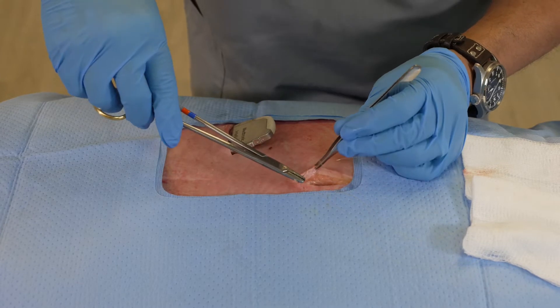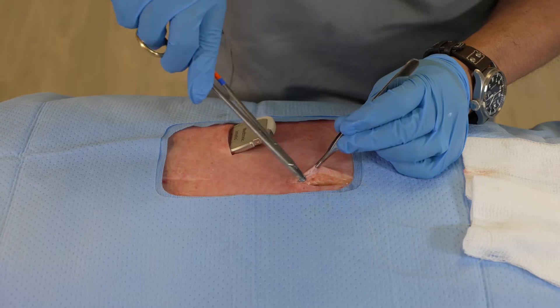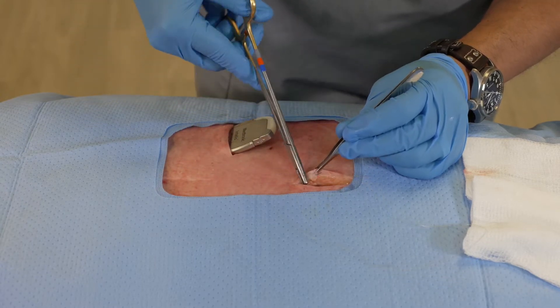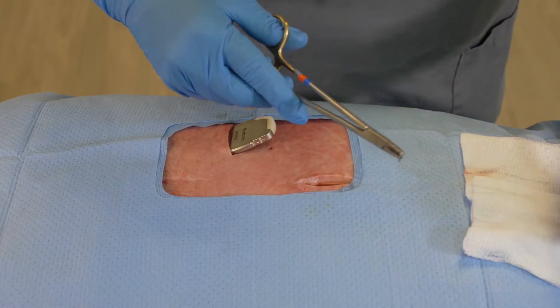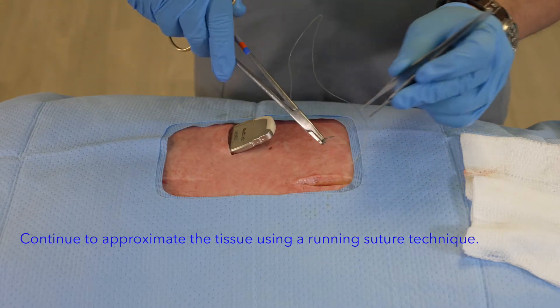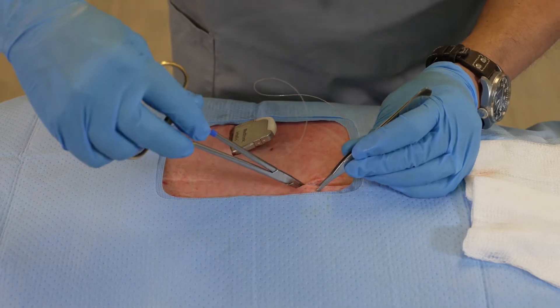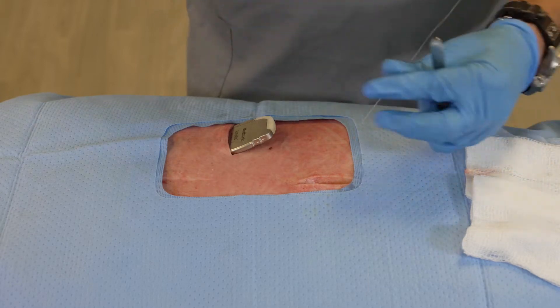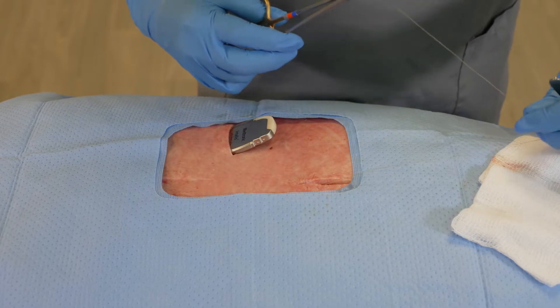What I'm going to do here is come back through and continue in this fashion for my deeper layer, and in doing so you can see the wound starts to approximate.